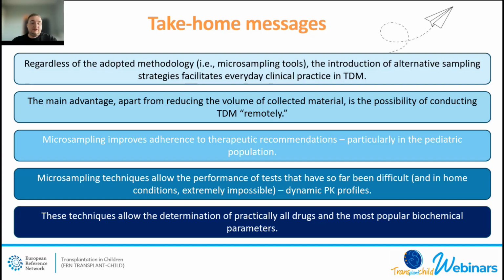These techniques allow determination of practically all drugs and the most popular biochemical parameters. Together with Agnieszka, we are involved in a few other projects concerning antibiotics, antivirals, antifungals, etc. in different populations in our hospital, and we found that this technique works.